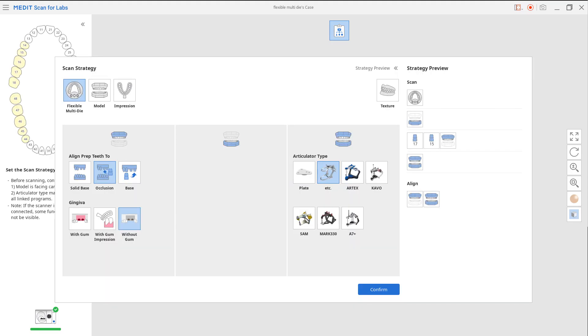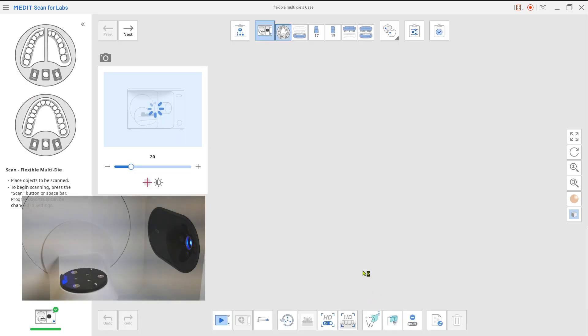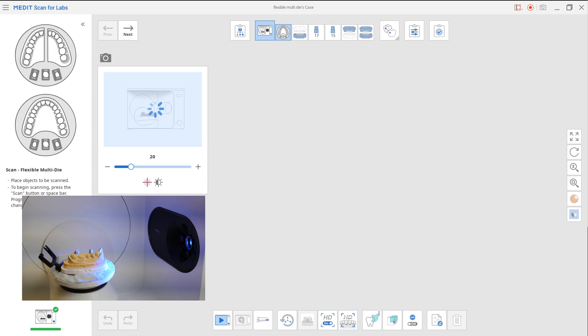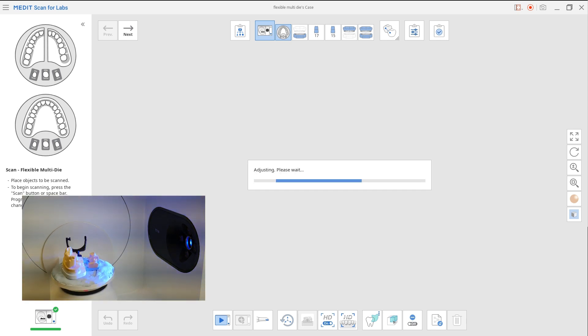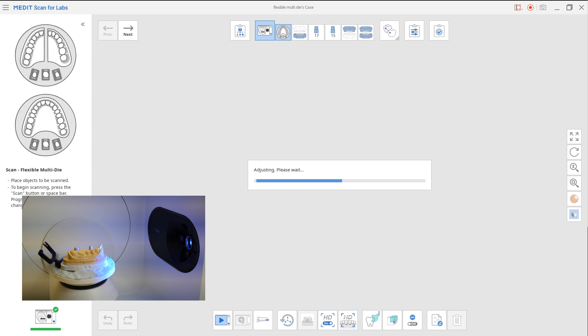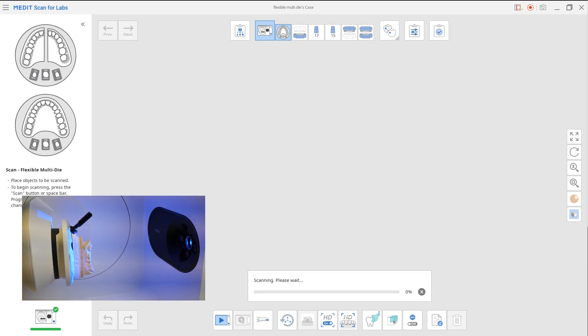Choose the flexible multi-die. Align prep teeth to occlusion and gingiva option for maxilla and mandible if needed. Place the mandible model and prepped teeth die from the maxilla on the flexible multi-die and perform the scan. Make sure they have space in between and are firmly placed on the jig.